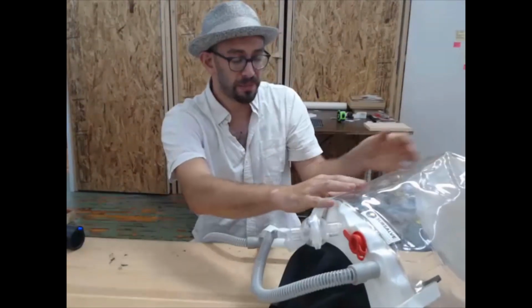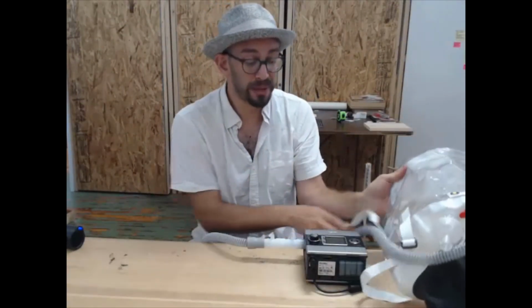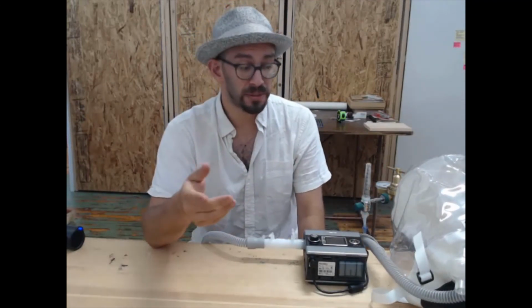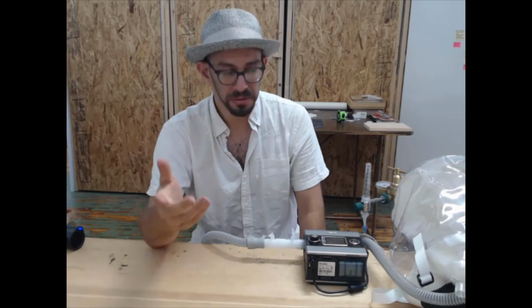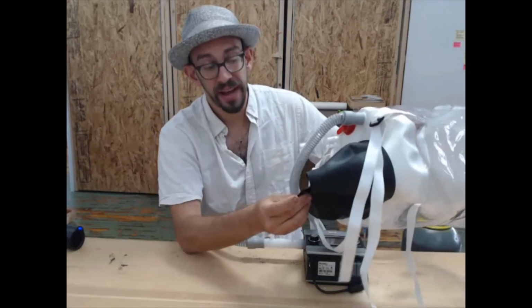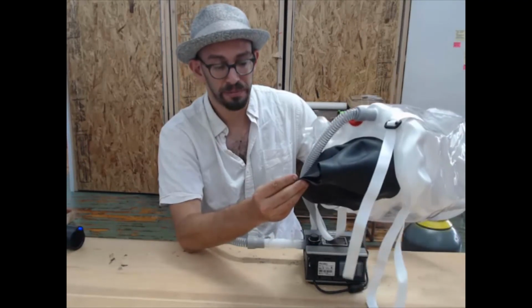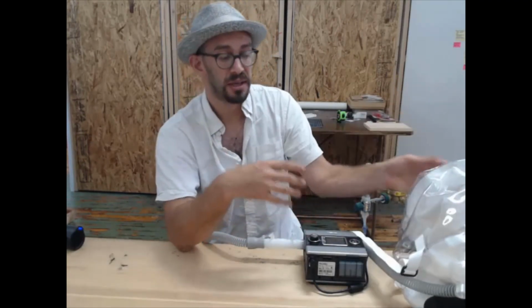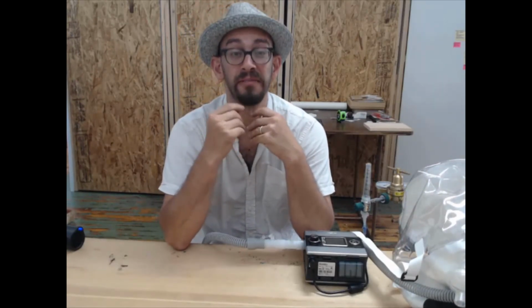You should ensure that the patient is comfortable in the helmet. Ask them. See if they are comfortable. If you need to, you can, with scissors, very bit by bit, trim this to a larger size on the neck seal if the patient complains it is too tight, but make very small adjustments if you do. There's obviously no way to make it smaller again.